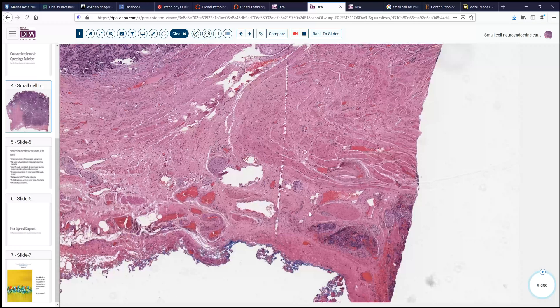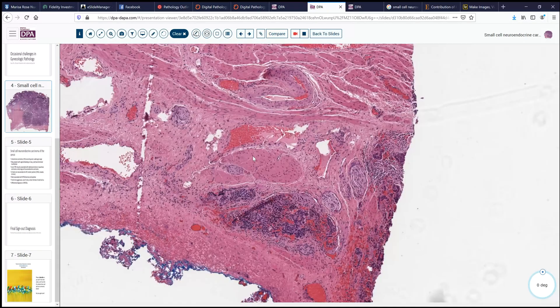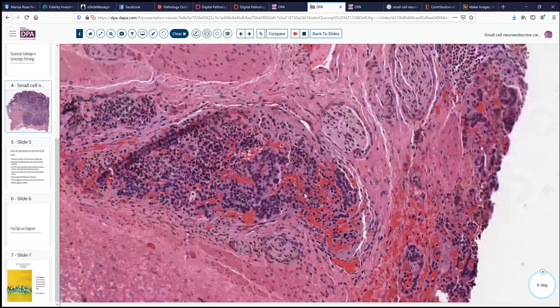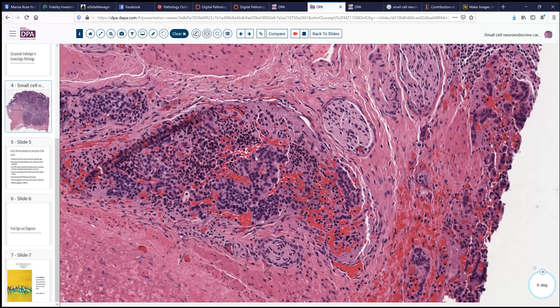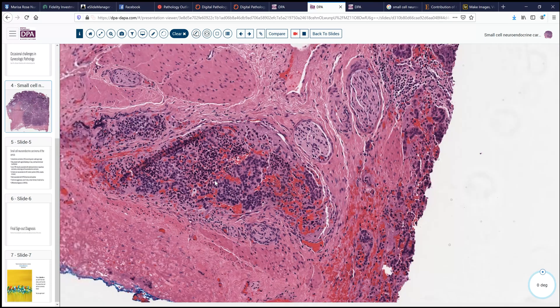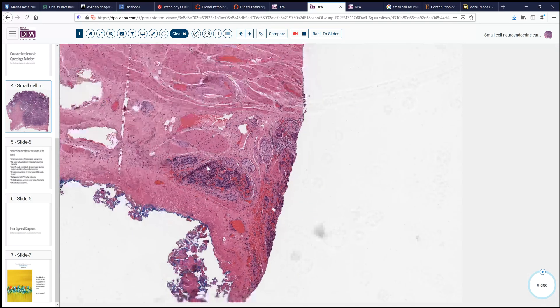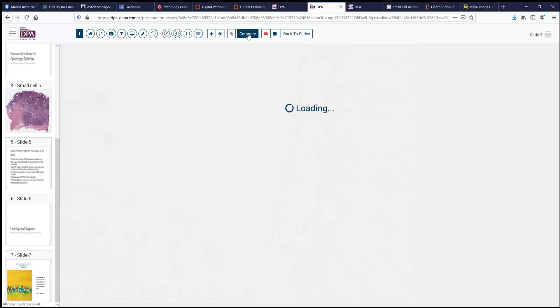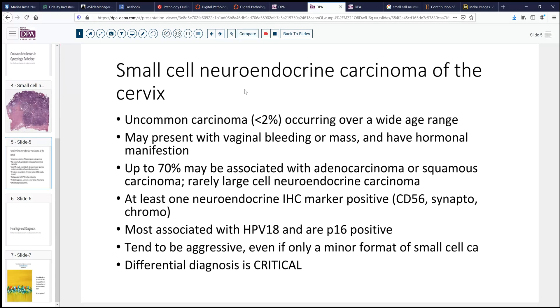Here we may even see some extramural spread, with probable nests of tumor cells very close to the deep margin, probably associated with lymphovascular spaces. In fact, although I don't have the immunohistochemical stains to show you, the findings in this case were those of a neuroendocrine carcinoma, as it was positive with several neuroendocrine markers — CD56 and synaptophysin being perhaps the most sensitive.